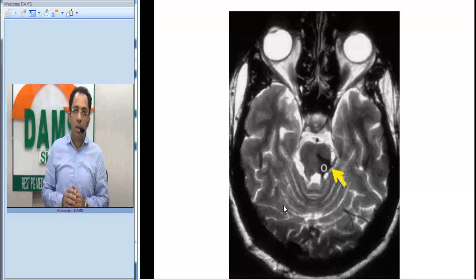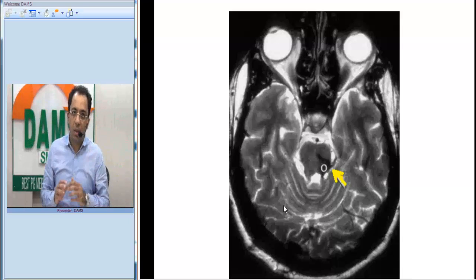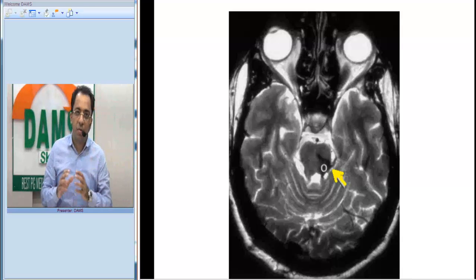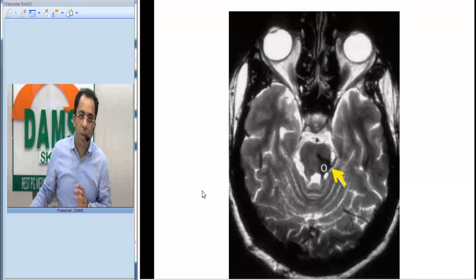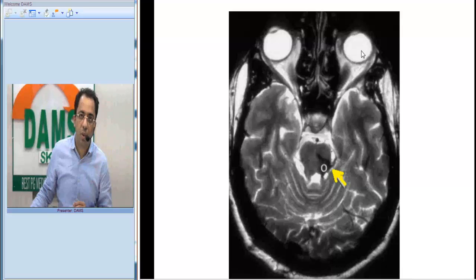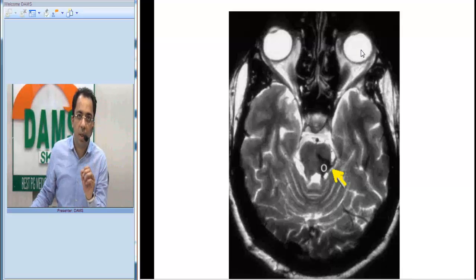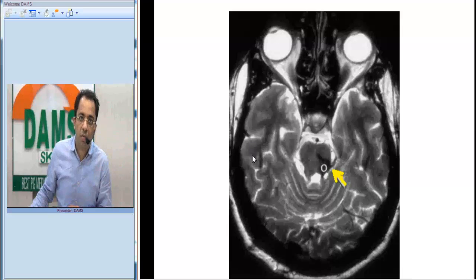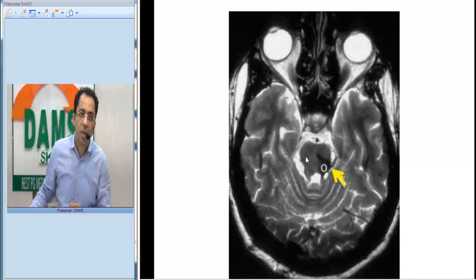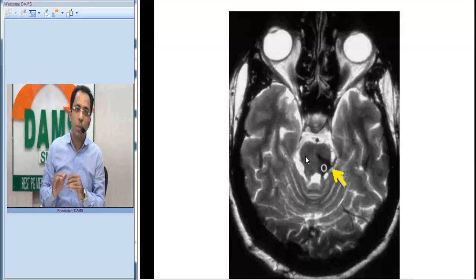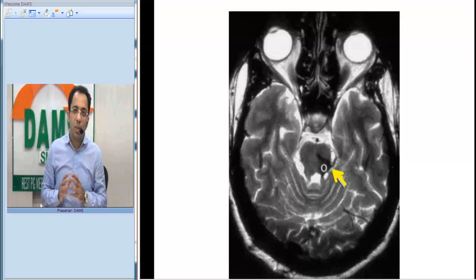What is the investigation that you can see in front of you? This is a T2 weighted MRI image. You can see the bones are dark, the fat is white, and the fluid is white. This is the area of the temporal lobes, this is the area of the cerebellum, and this is the area of the pontomesencephalic junction. So what is the finding in this MRI?